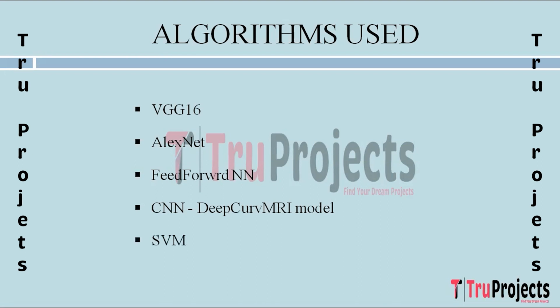The next one is SVM, that is support vector machine. So SVM is a powerful supervised learning algorithm used for classification and regression tasks. It works by finding the hyperplane that best separates data into different classes. SVM is effective in high dimensional spaces, making it suitable for image classification. In this project, SVM serves as a benchmark for evaluating the performance of deep learning models.